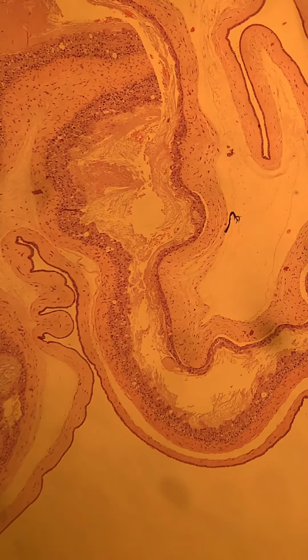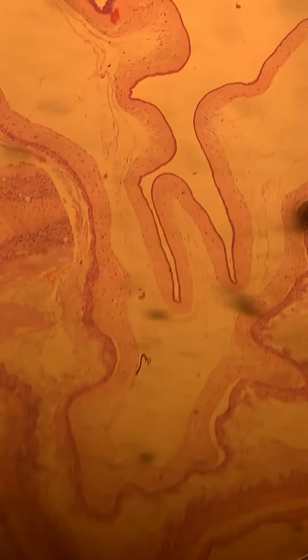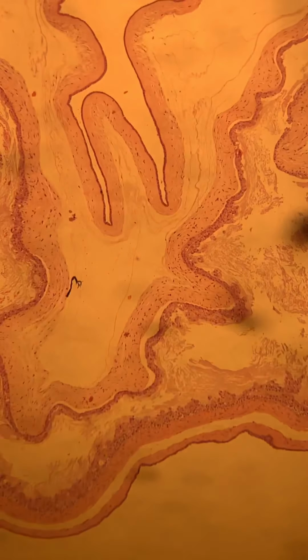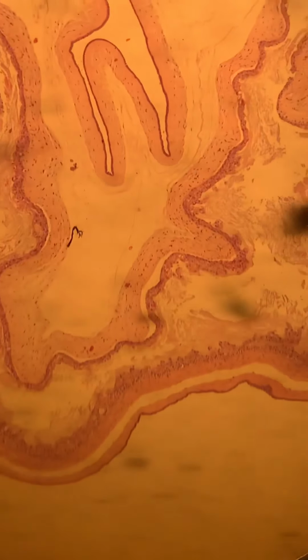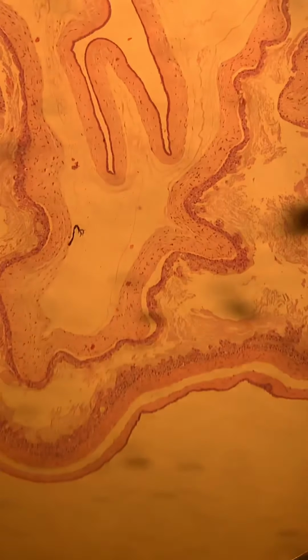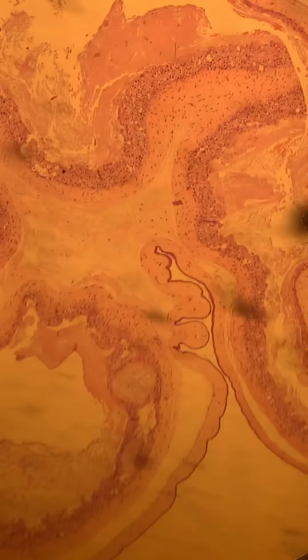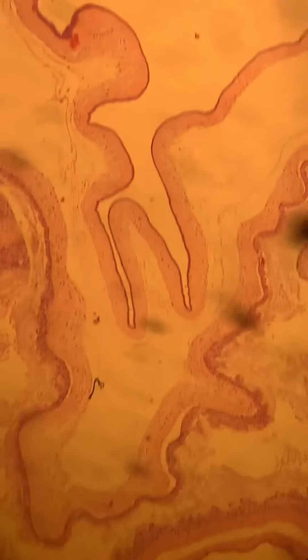Accuracy in twinning the placenta is extremely important, as the gross describer described the placental disc as a single placental disc. So that puts it in a monochorionic twin. And as we look at the T membrane, or transitional membrane, you can see that this is the amnion we're looking at now, because there is a chorion in between. If I continue to scan around, you can see that on either side of the chorion is actually a membrane, if I can get it back into proper focus right here. So let me keep on going around.